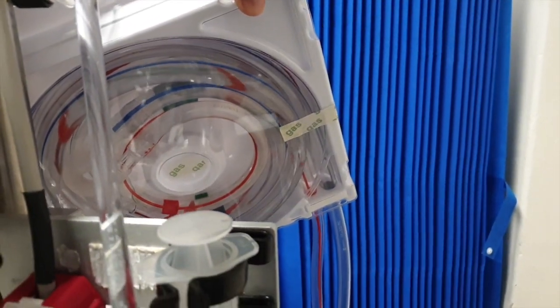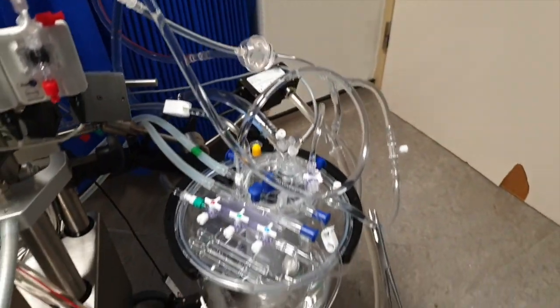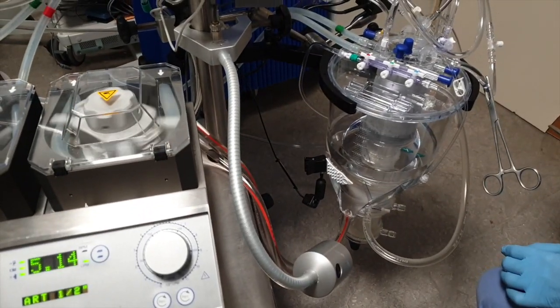Now the fluid is circulated onto the table pack, and the tubes — which are in the white tray — will be passed onto the table. This is kept sterile and will go into the sterile field.